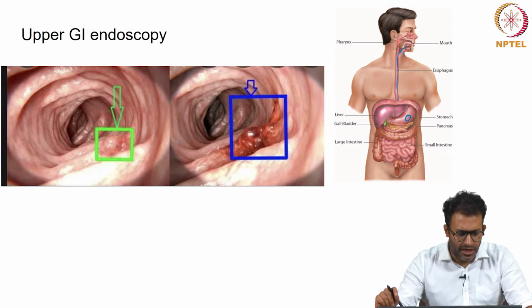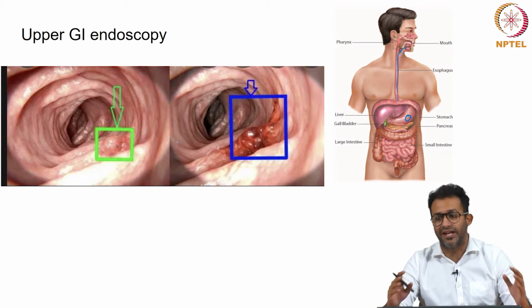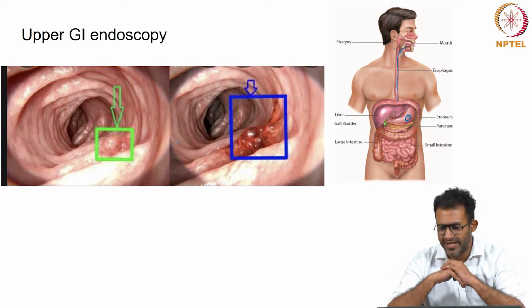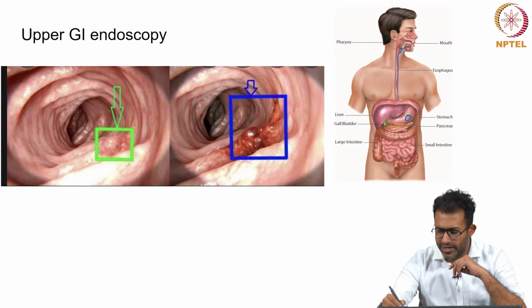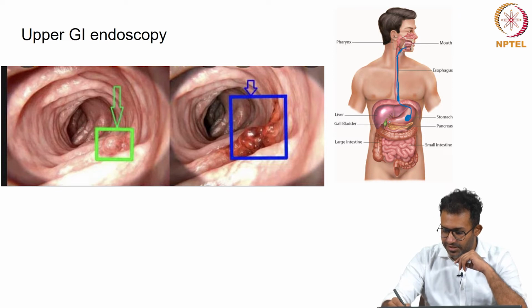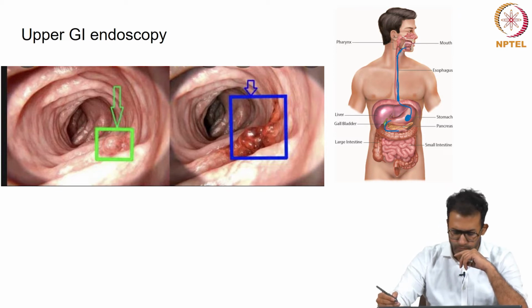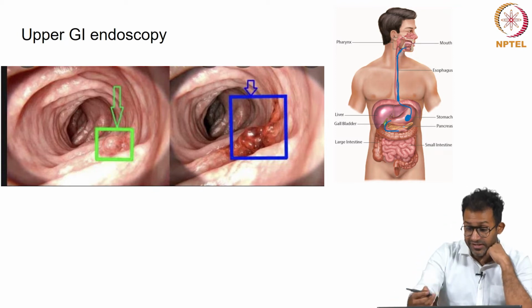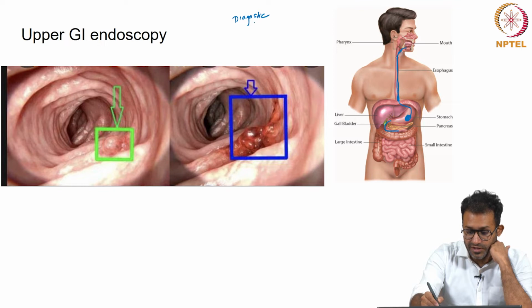Upper GI endoscopy is what we traditionally understand as endoscopy. When I say endoscopy, what I usually mean is just upper GI endoscopy. That involves putting a tube into your food pipe and it goes into the stomach, where I can visualize the stomach, and sometimes even the early part of the small intestine. Again, it can be diagnostic or therapeutic. When I say diagnostic, you can see if there is a cancer, and when I say therapeutic, again I can remove foreign bodies.